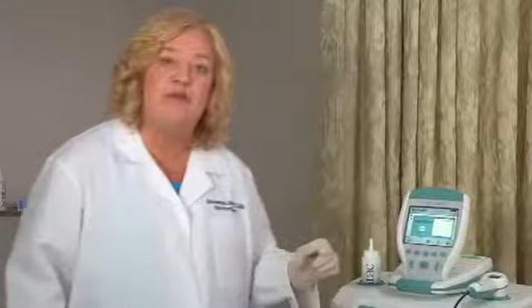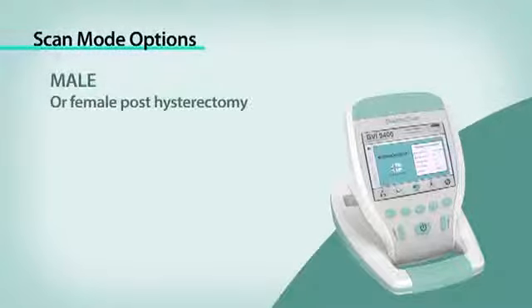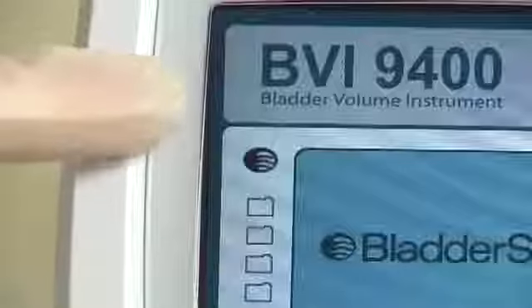Turn on the bladder scan by pressing the on-off button, which is right here. The bladder scan BVI9400 is designed to scan in three specific modes: male patient, female patient, and small child. A female patient who has had a hysterectomy should be scanned in the male mode, shown as a bladder icon.